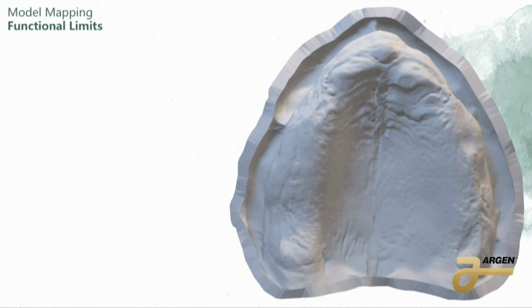If we set our teeth too far in the front, and I know we have patients that want to push their lip out, they have wrinkles, they want to push it out, suggest Botox, okay? If we're pushing it too far out, now that denture might pop down because we're not allowing the forces in the back to maintain the forces in the front, right? So how far forward can we set these? This depends on the shape of your ridge.